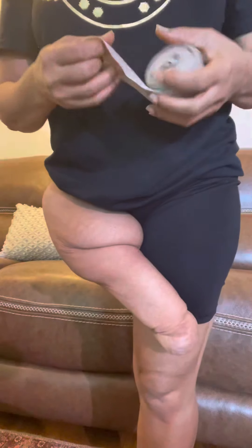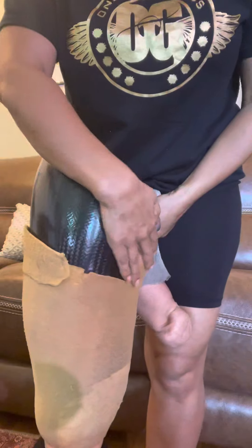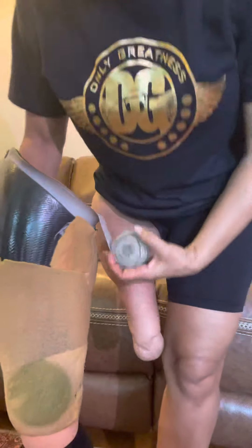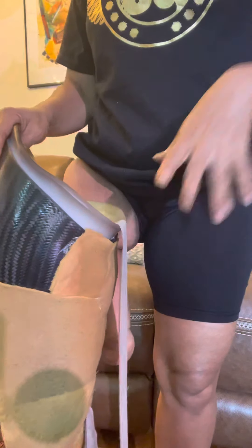Here's my prosthetic — I've customized it so don't pay attention to that. I'm going to pull the ace bandage through the hole where the valve goes. I'll release and take out the valve, and put this end of the ace bandage into the socket, pulling it out through the hole just a little bit — that's all you need. Let the ace bandage drop to the floor; you can put down a towel or do it on carpet, but try to keep the ace bandage clean.